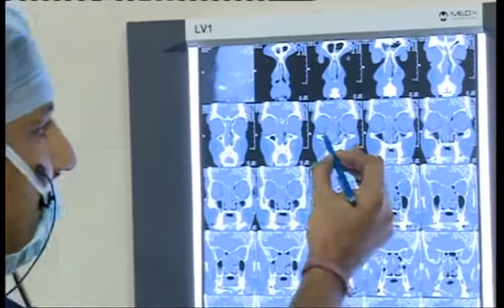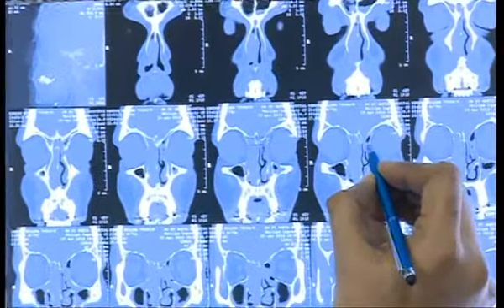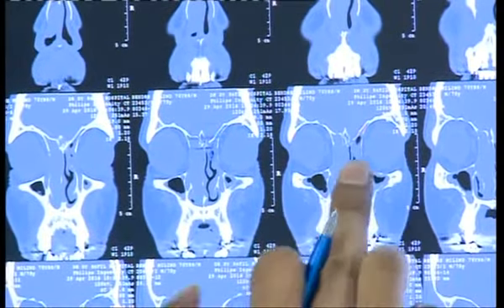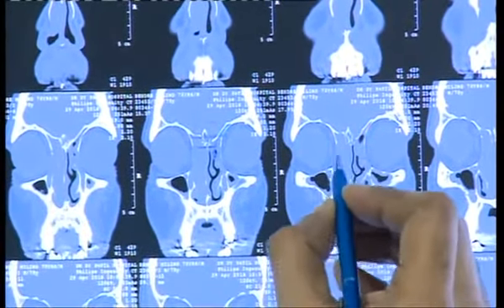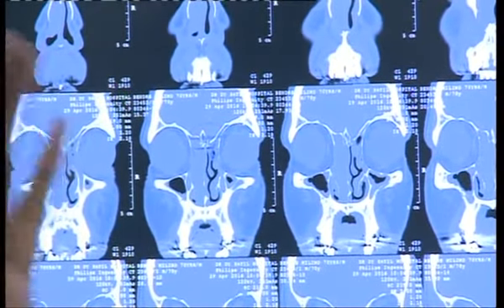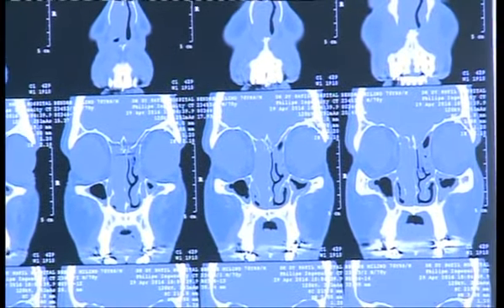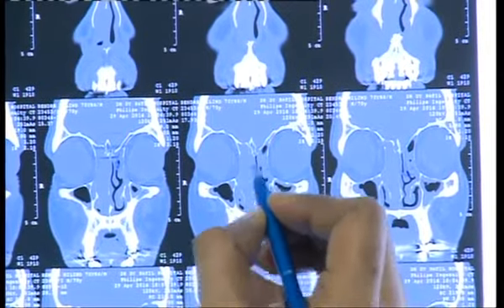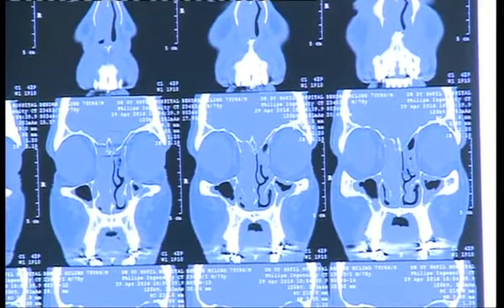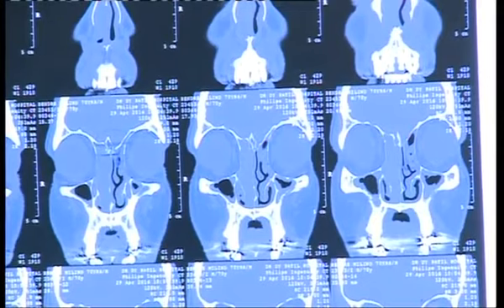Okay. Now, going behind, we are still in the frontal recess. Ashish, yes, we are going further behind. You can see again the same middle turbinate configuration very well. On both sides, the picture in the anterior ethmoid is different. We can see some of the cells in this region. The bulla should be there, but I don't appreciate it because of the opacity. That is completely opacified in this region, and you see the maxillary sinus becoming bigger, globular in shape in this region.